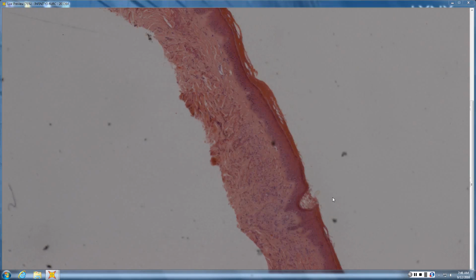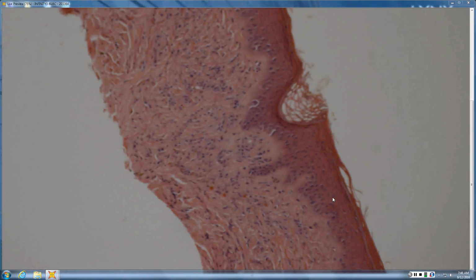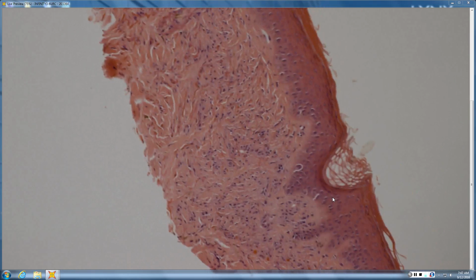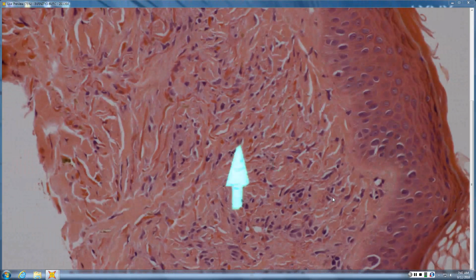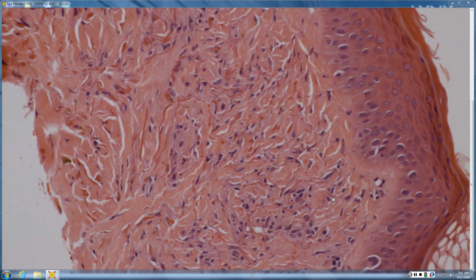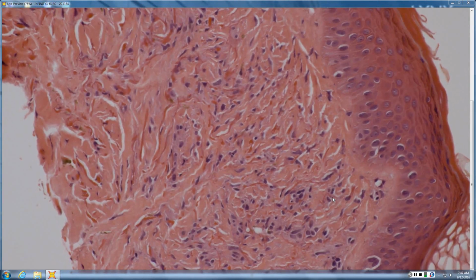Okay, David, we just read them. We have no control over how deep a specimen they give us. That's right. So it looks like we've got a sprinkling of melanocytes along the epidermis. I'm not really appreciating, there is some pigment in the dermis, so could be some melanocytes down there. Yeah. And in fact, if you were to stain it, every one of these spindle cells, every little round cell here, which is just a spindle cell cut in cross-section, and all the spindle things, they're all melanocytes.